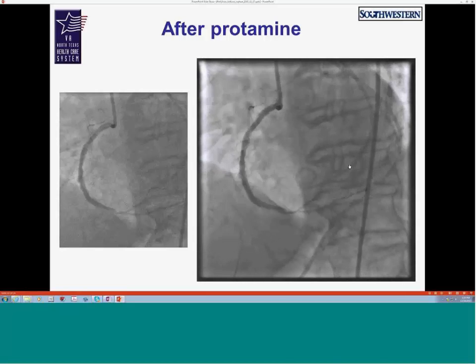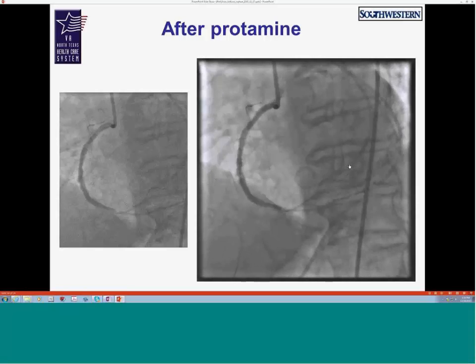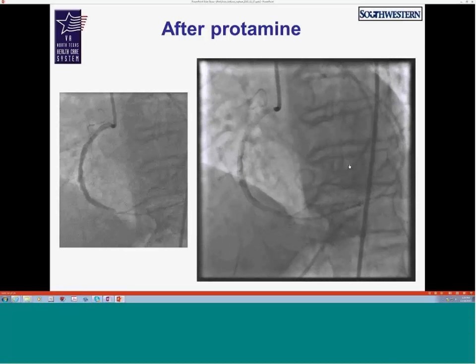And the patient did well, actually. He was stable, no more effusion after this. We pulled the pigtail the following day, and he went home a couple days later. But again, that was probably the worst perforation I've ever had.